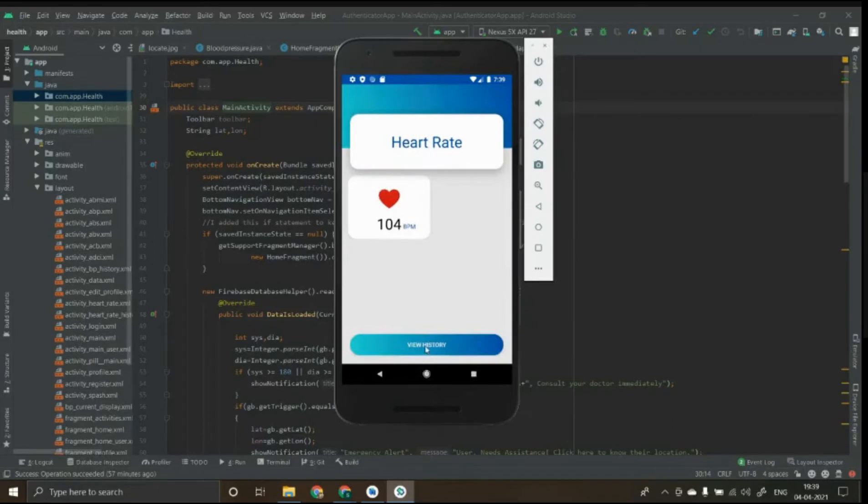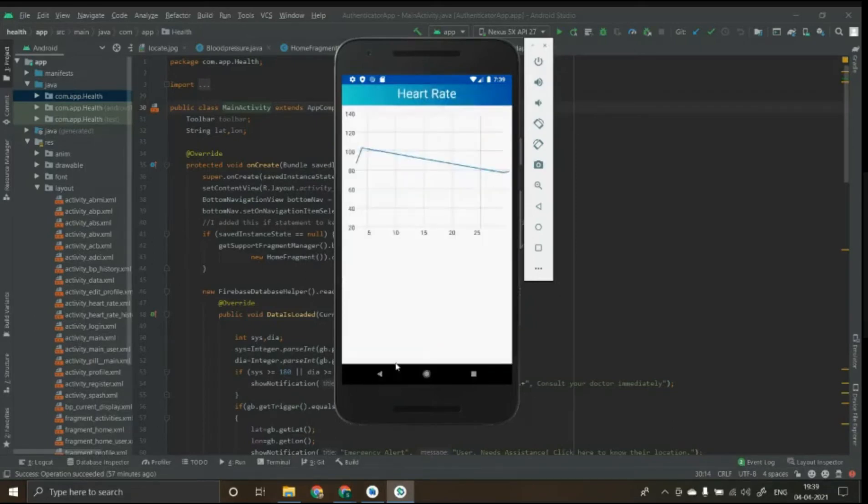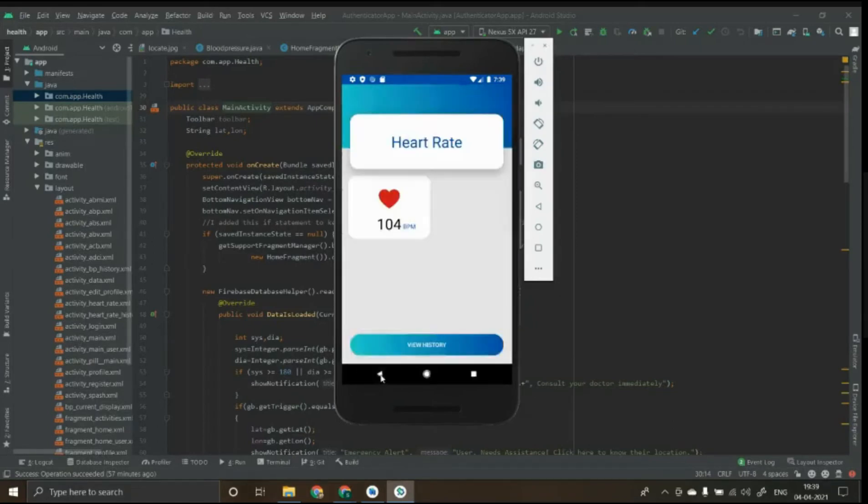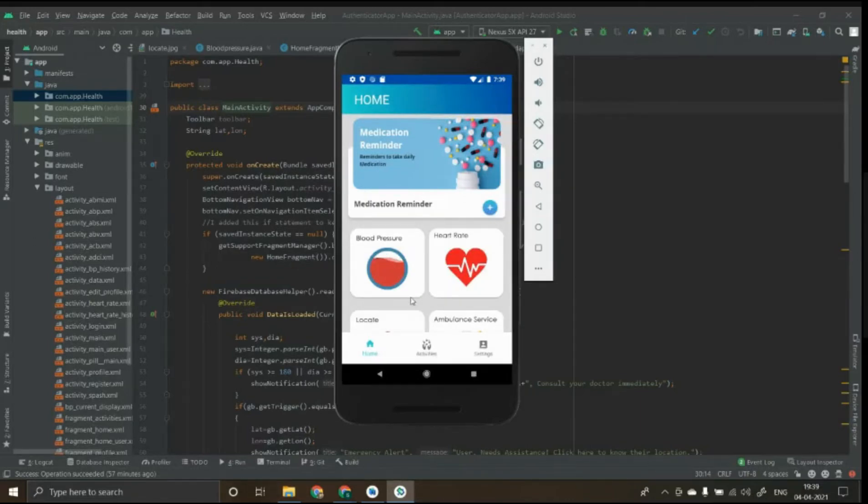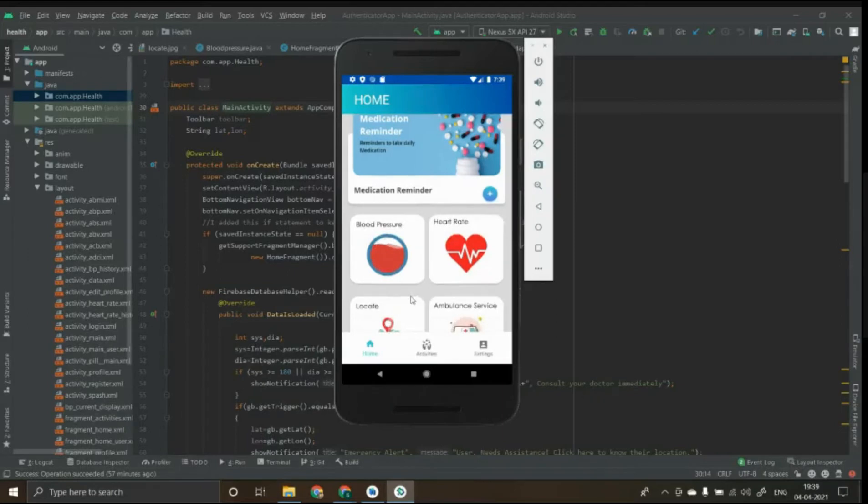In case of major variations in the BP or heart rate, the monitor is alerted. The locate module is used to locate the patient through the GPS module embedded in the wristband. This in turn redirects to the Google Maps as shown.